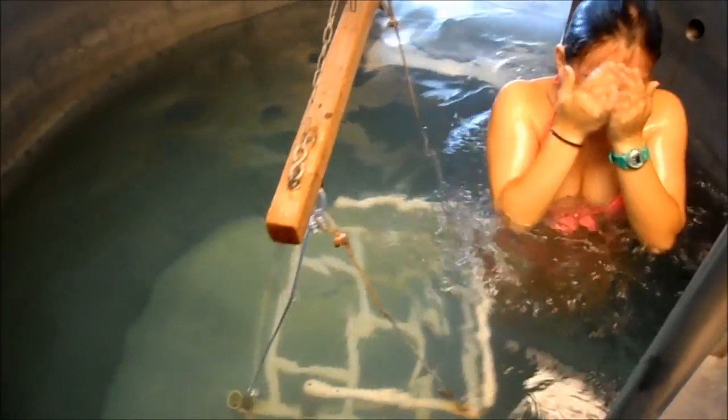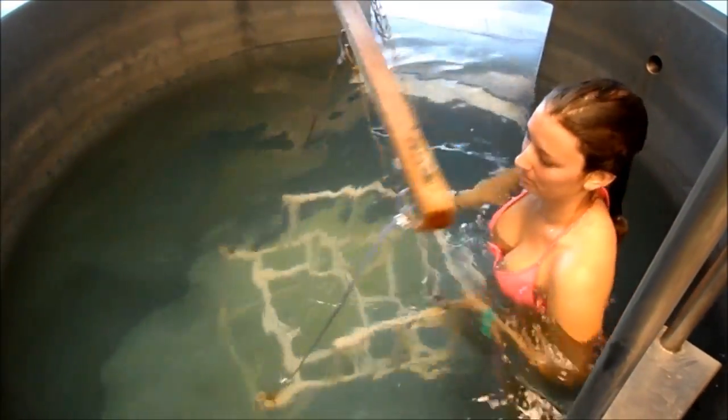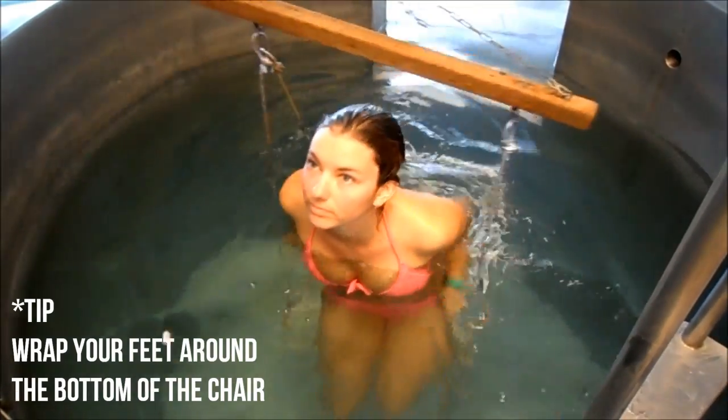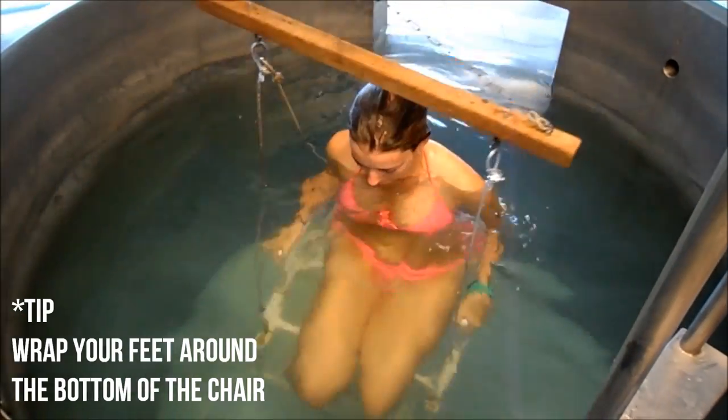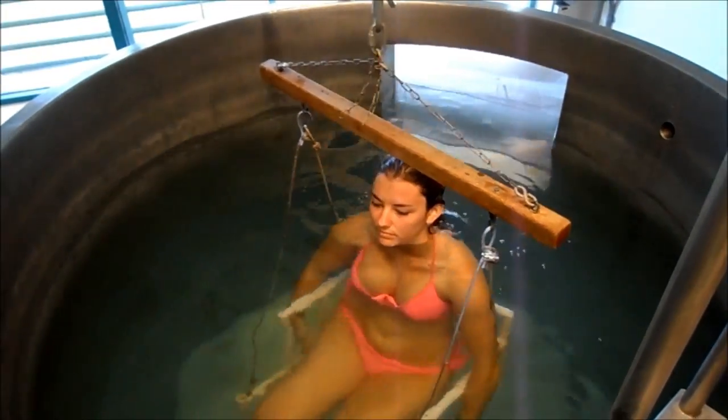Your client is going to need to get everything wet, including their hair. A good tip to give your clients is when you sit in the chair, try to wrap your feet around the bottom of it. You don't want your client to be touching the sides or the bottom of the tank because that could interfere with the reading.